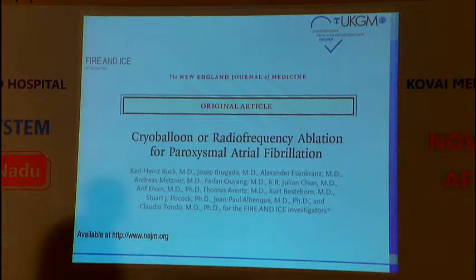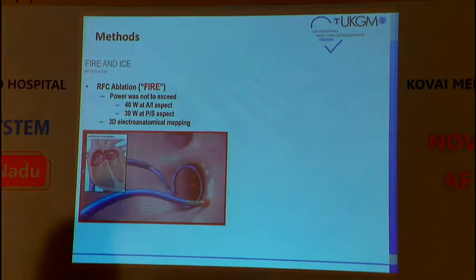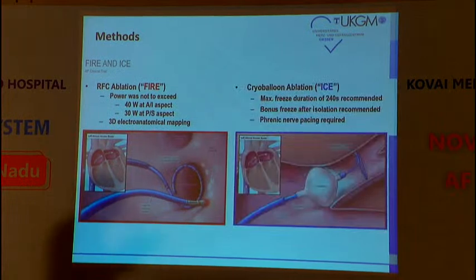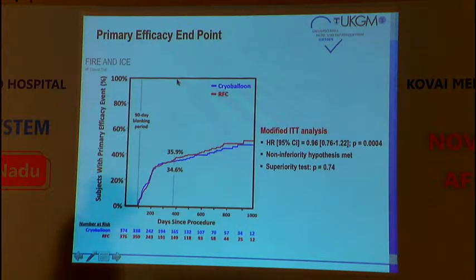You heard already about this trial. I will do it very, very quick and short. This is the largest ablation study which has ever been performed all over the world. This is the Fire and Ice study, which gives us basically the evidence to do this. And this study compared one-to-one cryo versus RF ablation, and I do it very short now. It was a one-to-one randomization with 700 patients, and the outcome was, yeah, what was the outcome?